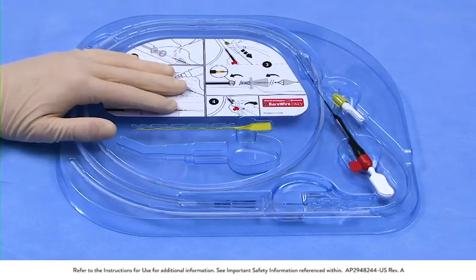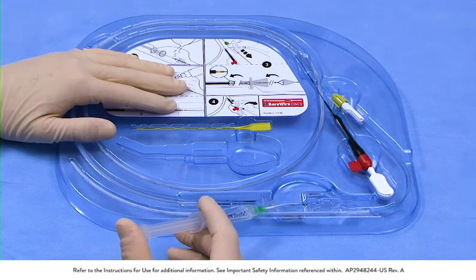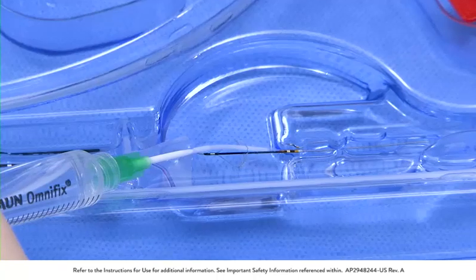To remove any air bubbles from the filtration element, place the white flushing tip gently inside the filtration element and flush until all air bubbles are removed.